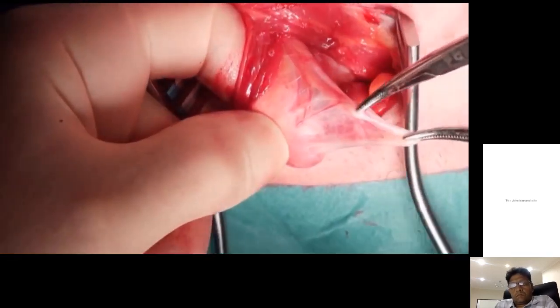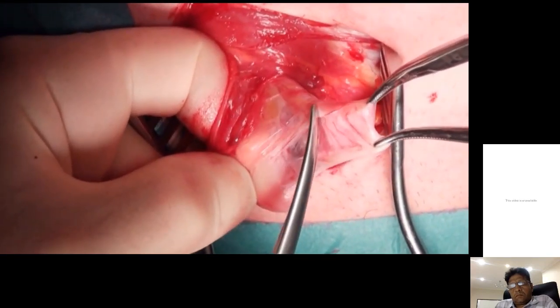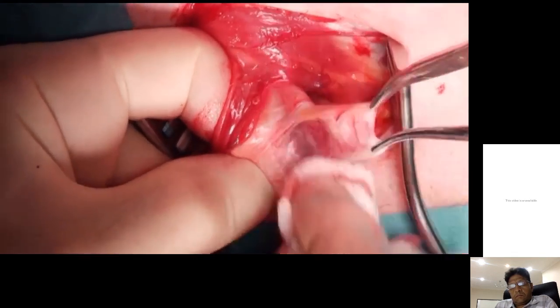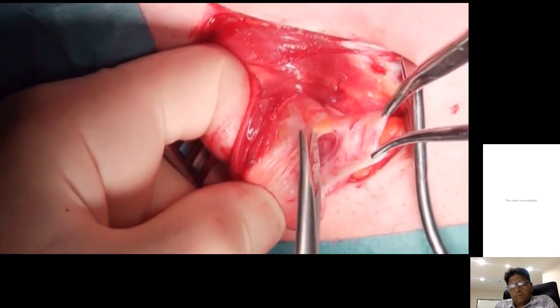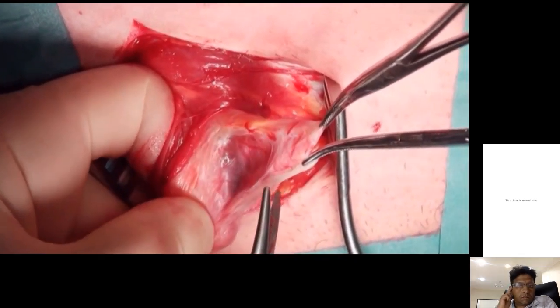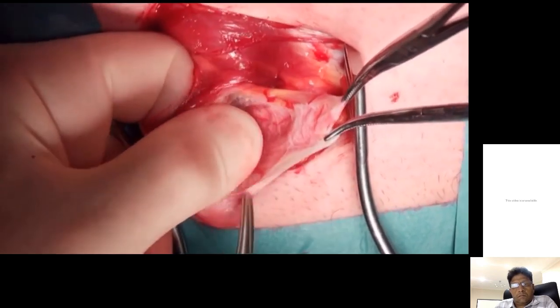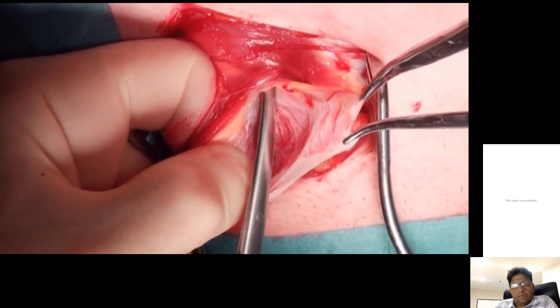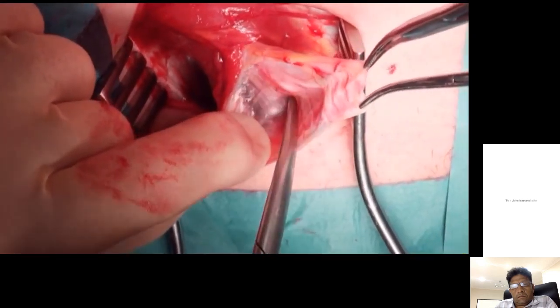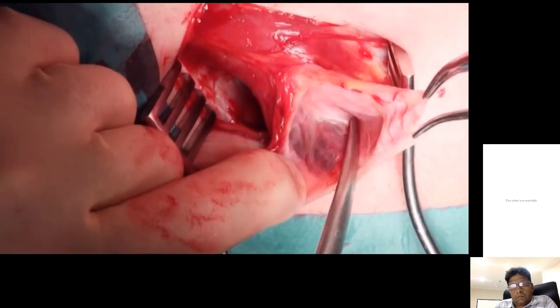And we just need to manoeuvre off all the surrounding tissue, so we've just got the sac isolated, and we can do this by a variety of methods. You can scissor everything off, you can use a swab, whatever takes your fancy, whatever seems to be working at that particular moment. Some sacs are very, very tough, difficult to dissect out. Some are very, very flimsy indeed, and will split. You just pick them up with a pair of forceps, they split.